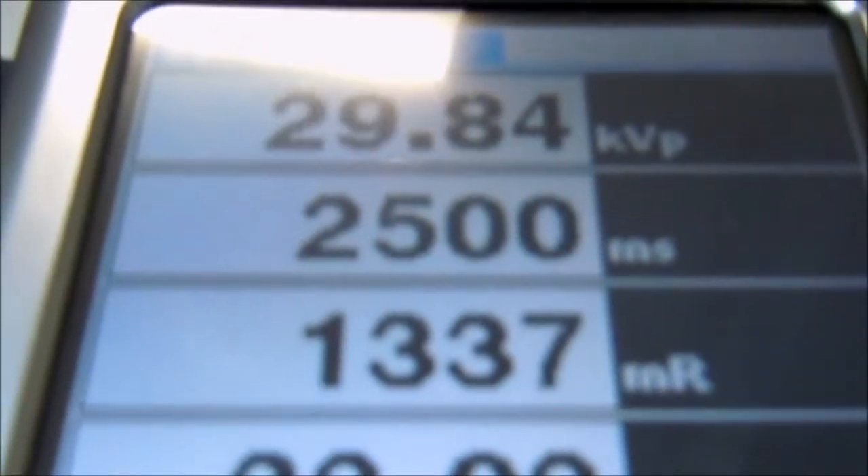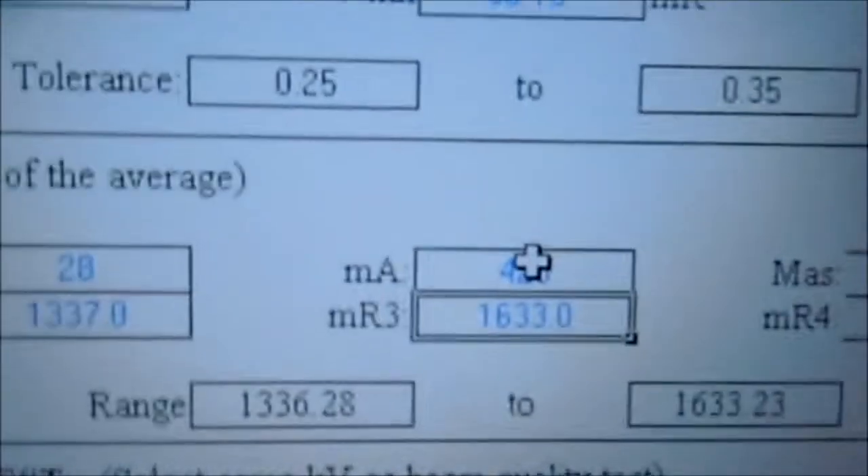Take another shot. While periodically we're letting the tube cool. It's processing. And again we get 13.37, so we enter here 13.37.